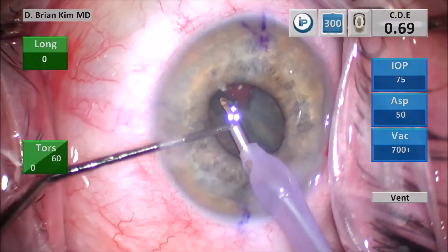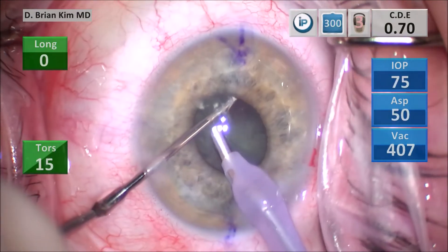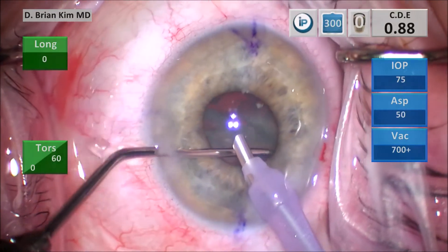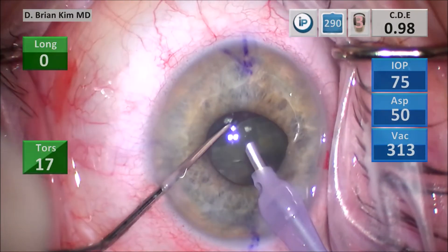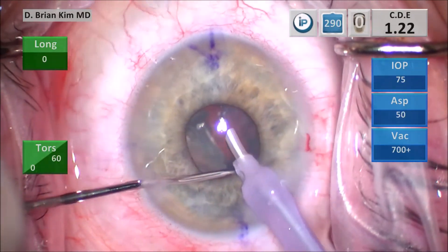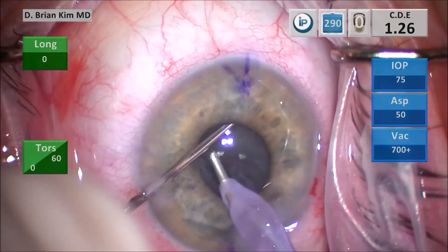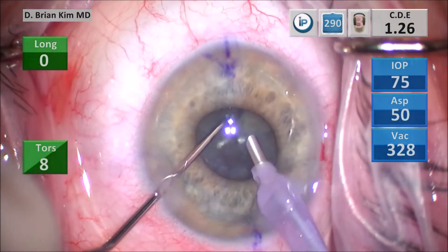I perform this without using any ultrasound, aspiration, or vacuum. I do this to minimize use of energy but also to grab the lens material in a very controlled manner. By using mechanical forces only, I minimize risk of damage to other structures. I use my chopper to prolapse the material into the central safe zone — it acts like a little hook to pull the lens material toward me without using aspiration and vacuum, which can inadvertently grab structures you don't want to grab.